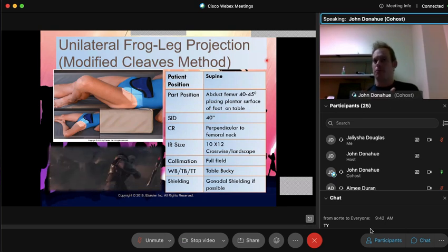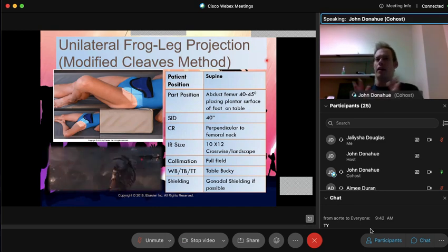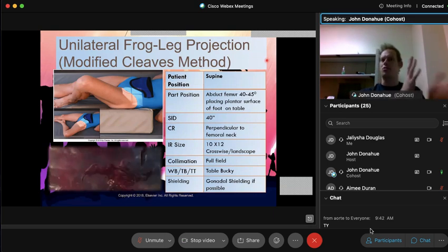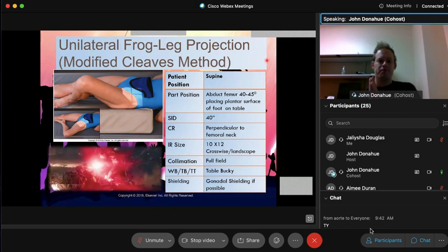Now, for the hip, they'll always go ahead and order a lateral hip with an AP hip every single time. A lot of times with the protocols at Harris Health as well, though, they're going to order an AP pelvis with one unilateral hip on the side. It depends on what they're looking for. So you can expect that sometimes as well. But if they do have an AP hip, they're always going to include this lateral as well.